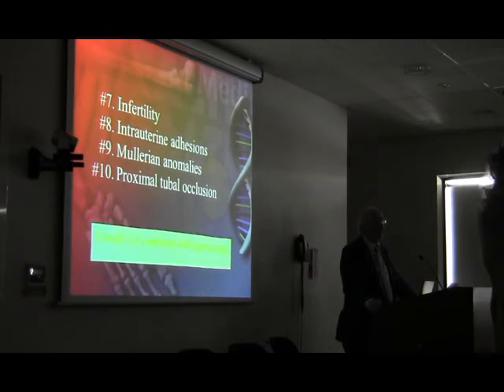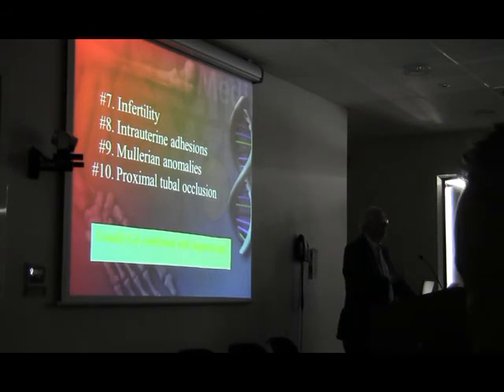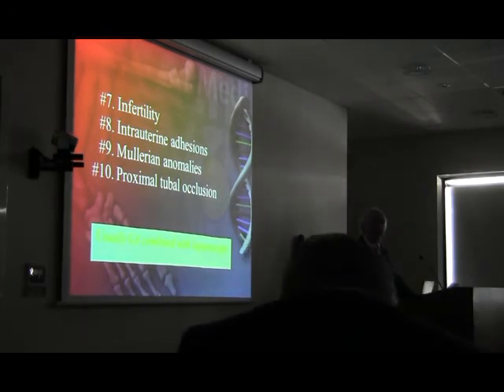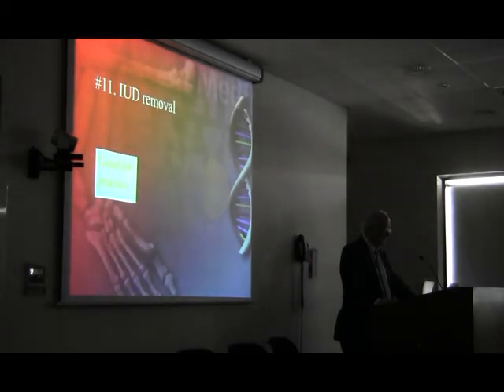If you've got somebody who needs a septum, you just want to get the thing done properly. There aren't that many of them, and I don't think that in the Irish setup there's any great advantage in trying to do these patients as walk-ins. Maybe if you had more of them. But I think there's plenty that we need to do before we start doing difficult adhesions. Straightforward ones, fine, all right. But some of these can be quite tricky cases, and you want to have yourself well set up to do them.